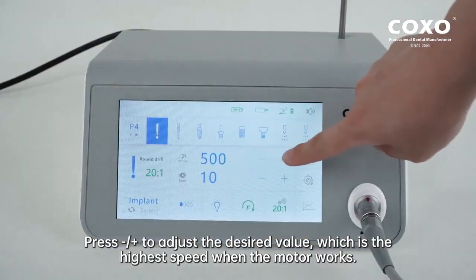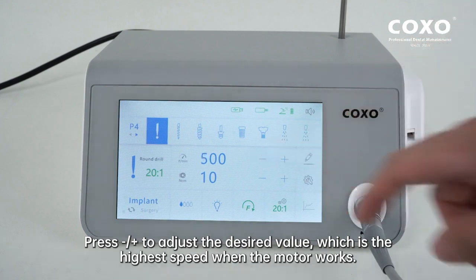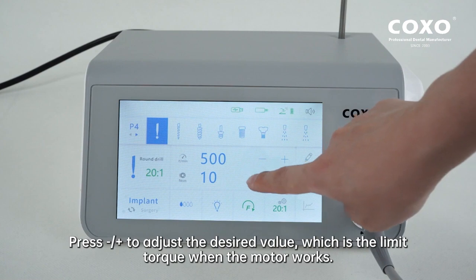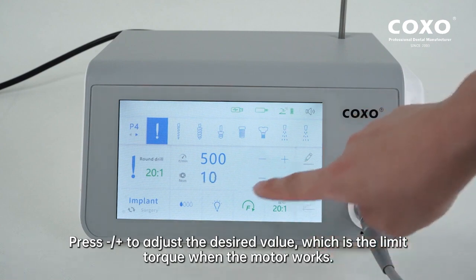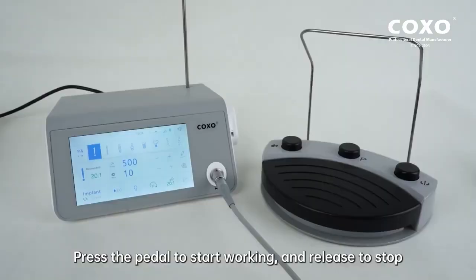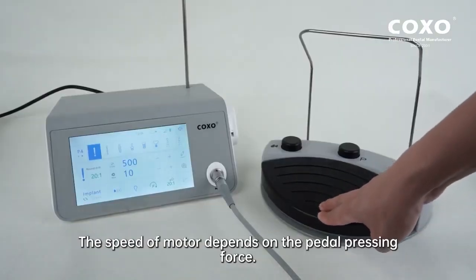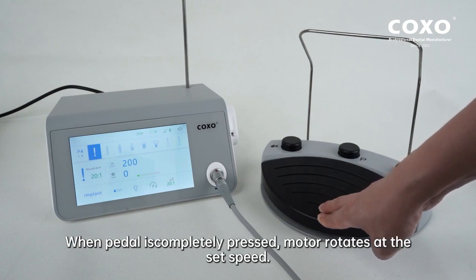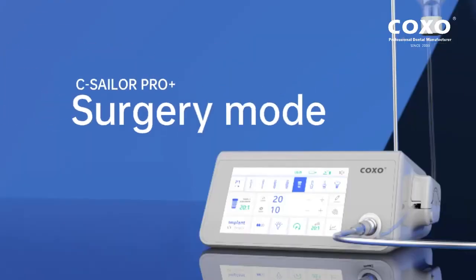Press minus/plus to adjust the desired speed value, which is the highest speed when the motor works. Press minus/plus to adjust the desired torque value, which is the limit torque when the motor works. Press the pedal to start working and release to stop. The speed of the motor depends on the pedal pressing force. When the pedal is completely pressed, the motor rotates at the set speed.